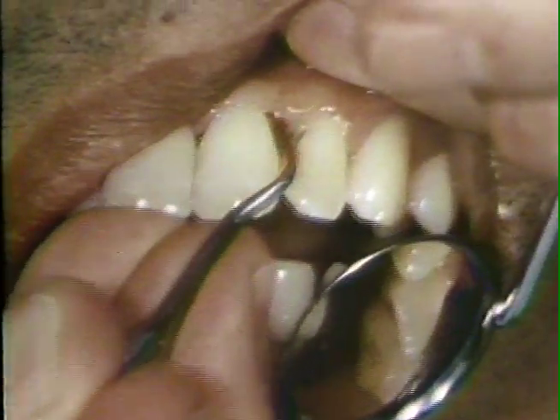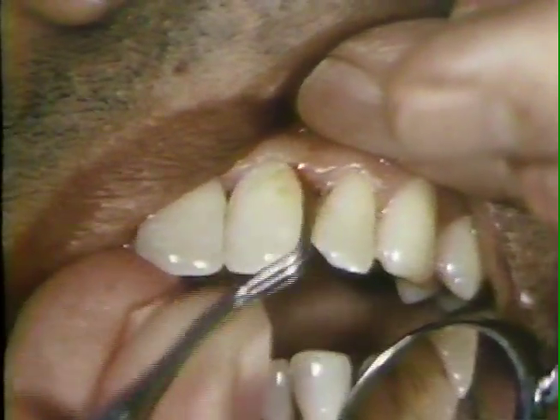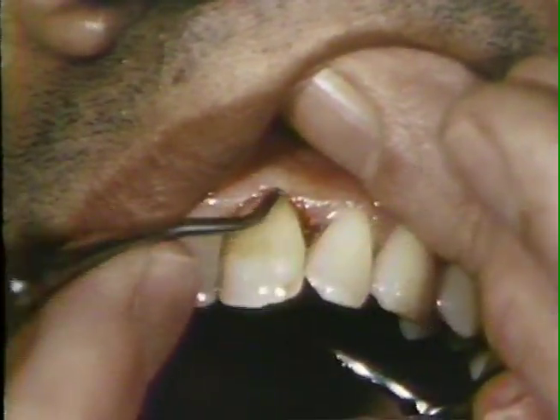The cemento-enamel junction and root surfaces are smoothed with a periodontal file, first on the distal side and then on the labial side. Even if no discrete particles of calculus are present, it is desirable to freshen the root surface by planing. Obviously, a thorough familiarity with the contour of the gingival attachment is essential before commencing the scaling and planing procedures.